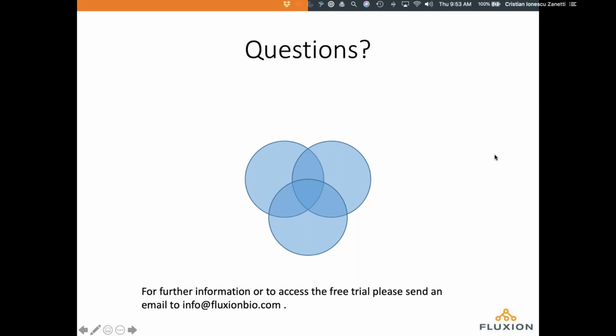So this is significantly superior to just saying, okay, I'm going to run replicates and then use a allele frequency threshold in both replicates and then do a union of both calls. I can tell you, because we've done direct comparisons with that type of approach, that by using the correct statistics and building up the background model to feed into those statistics, you get much better performance with this MAPS approach. The analysis really integrates all of the background information and all the sample information into your results.